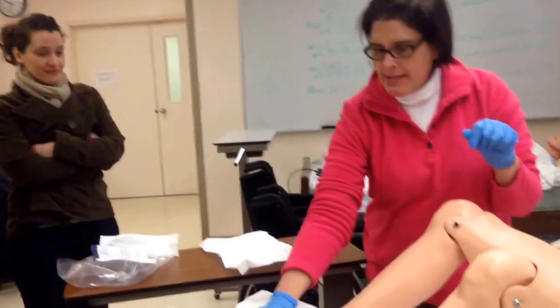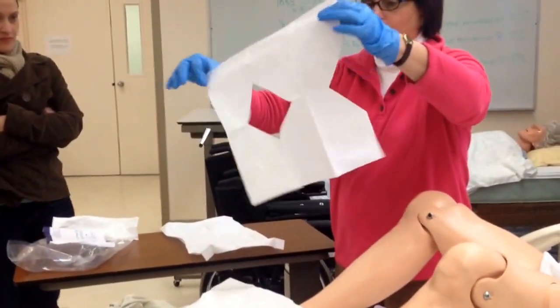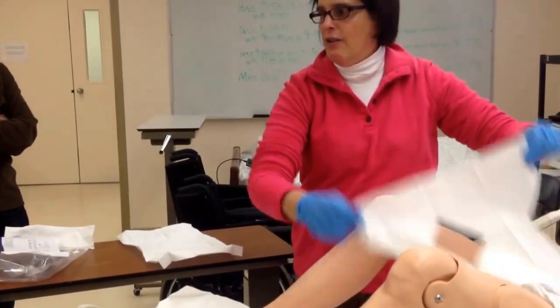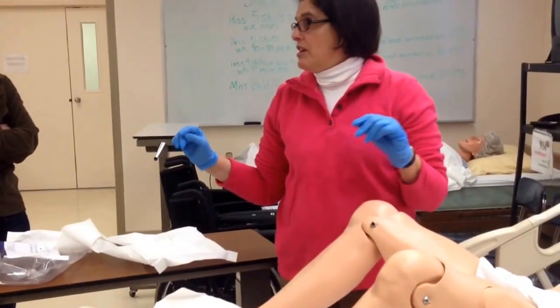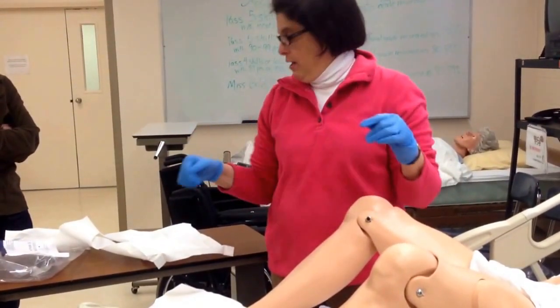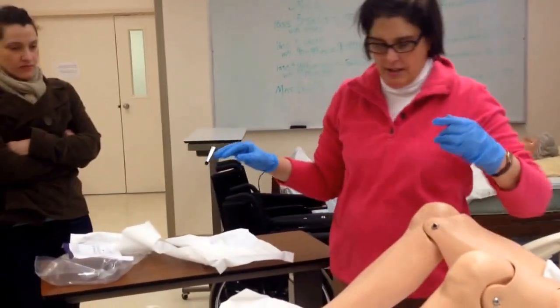Okay. Now this is another drape. It's a fenestrated drape, and the reason it's called a fenestrated drape is there's a nice hole in the center. And what this is supposed to do is go over the patient like so. I don't use it. It's one more thing that I have to worry about. Once you put the catheter in, then you're going to have to try to tear that, and it's not always easy. Okay, that's one less thing I need to worry about.